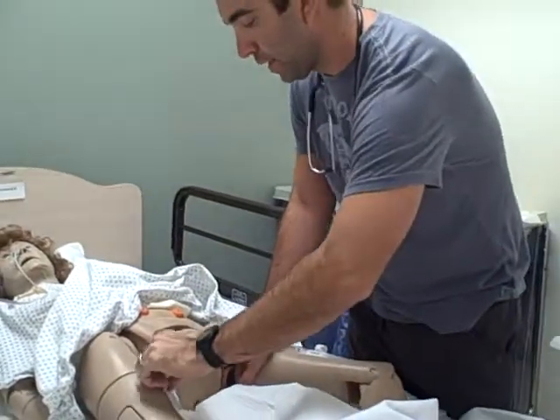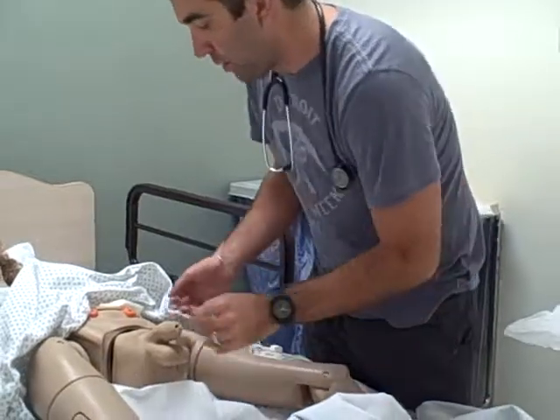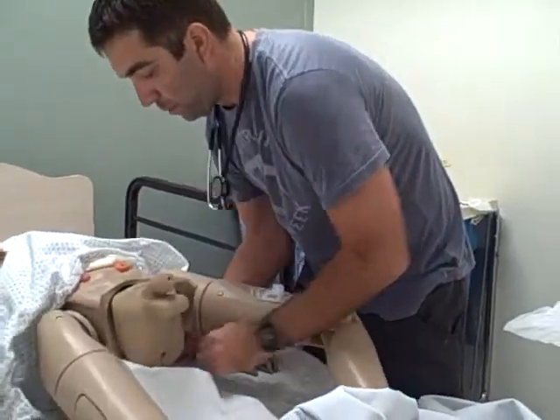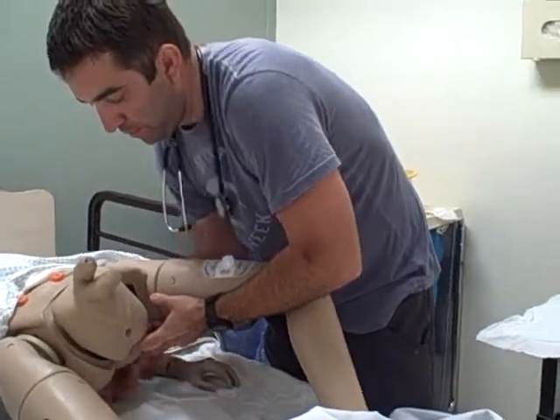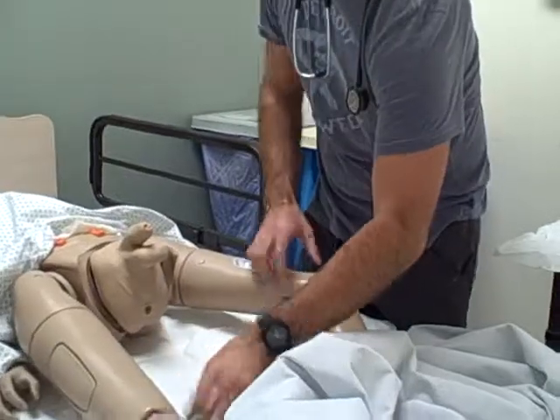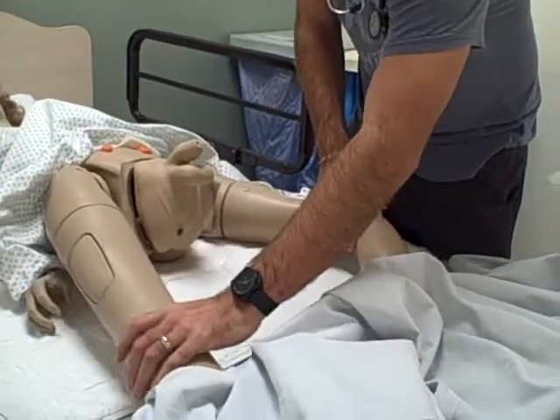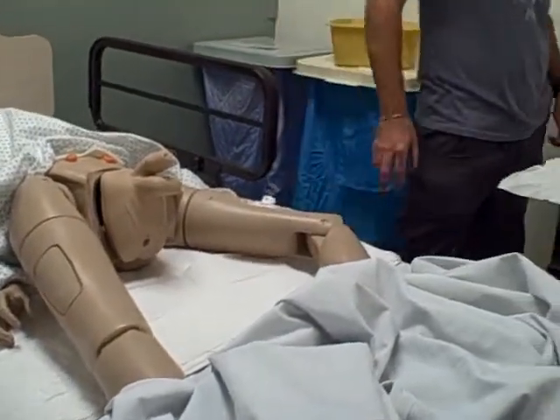It's not really gonna stay completely sterile, obviously, because I don't have sterile gloves on right now. I'm gonna have the patient pick up their butt and move it underneath, so that it stays clean. Okay. And I'm gonna kind of help out the patient here and open up the legs, so everything's exposed nicely.